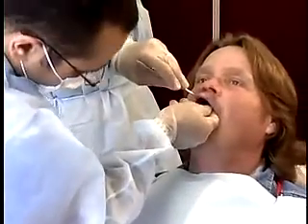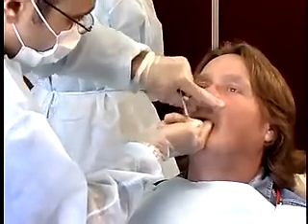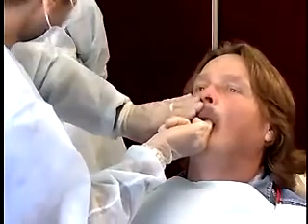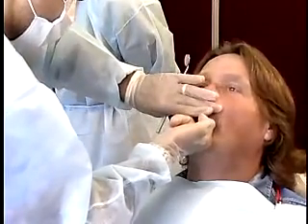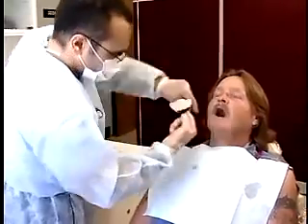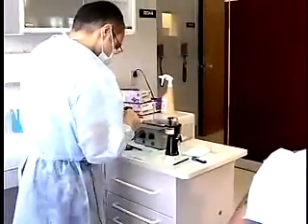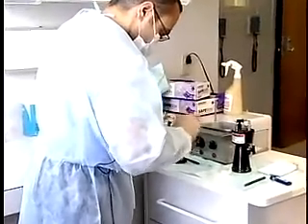Reflect the cheek with a mouth mirror and rotate the tray into the patient's mouth. Seat the tray in the patient's mouth. The upper lip is gently manipulated outward, downward, and inward. When set, remove the tray. Repeat the procedure. The compound should be rounded with no void, be symmetrical in shape, and should not be glossy.